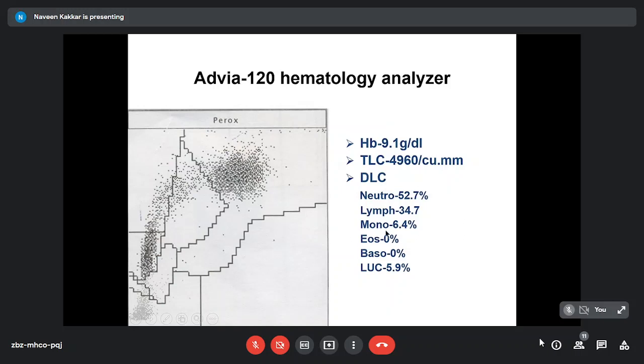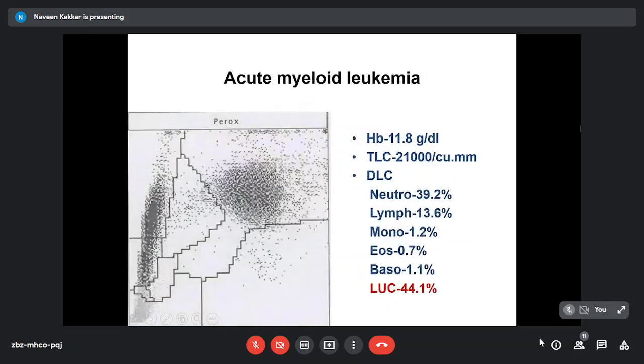The point I'm trying to make is that large unstained cells in a normal individual are usually less than 7 to 8%. This is 5.9. There may be some cells which do not pick up MPO very well, or large lymphoid cells. Nothing to worry. If you have a leukemia, let's say acute myeloid leukemia, there are neutrophils, yes, and lymphocytes, 13.6. But if you look in this zone now, large unstained cells, that population is 44%. So the instrument is telling us there are large cells which seem atypical or blastic, which do not have good myeloperoxidase activity. Maybe lymphoid leukemia, maybe myeloid with less MPO activity.